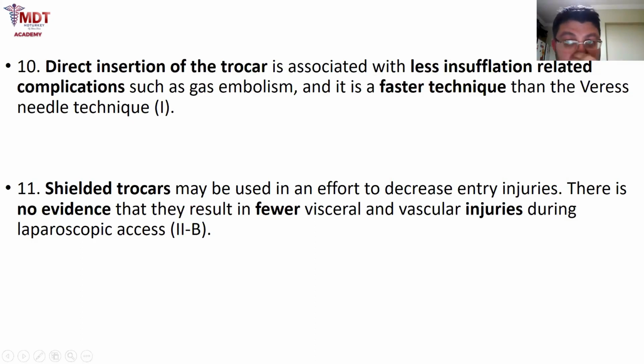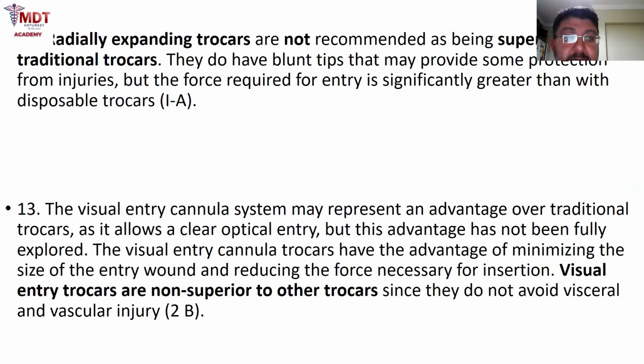Mostly in Turkey, the gynecologists are using this direct trocar insertion technique. Approximately nobody is using the Veress needle. Further, nobody is using shielded trocars. Nobody is using visual trocars. Mostly they are using this direct trocar entry technique.